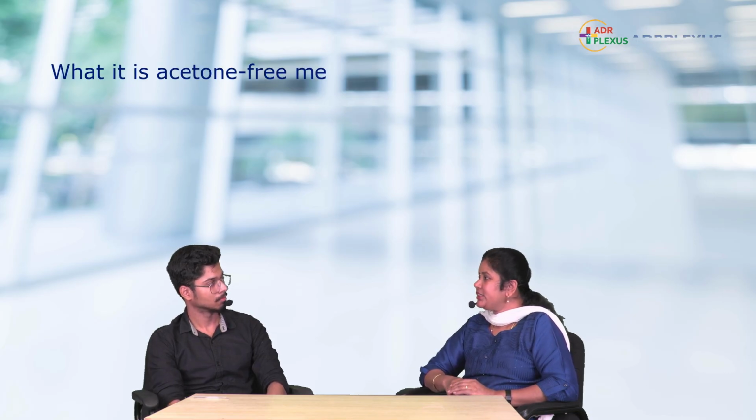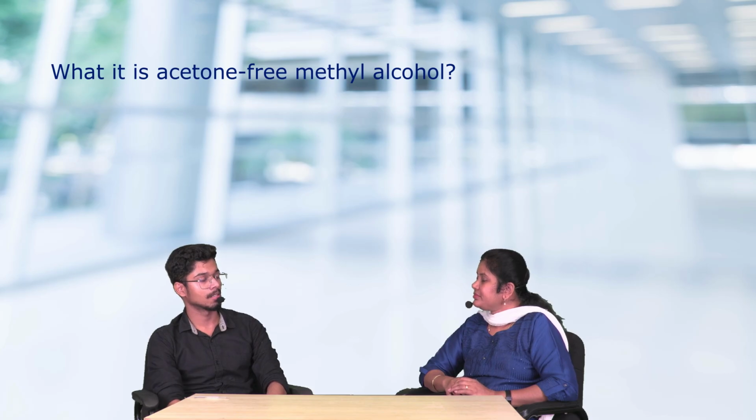And acetone-free methyl alcohol is used to fix the cells to the slide. Why should it be acetone free? Acetone is a highly lipid solvent, so it ruptures the cell membrane, thereby the cells are shrunken, distorted or crenated if you use acetone.